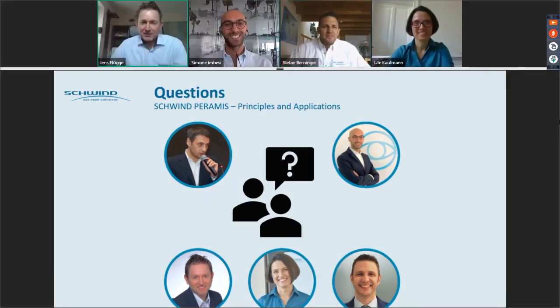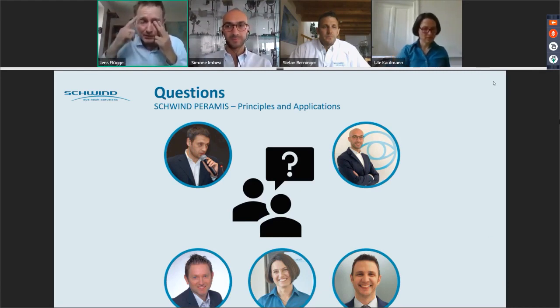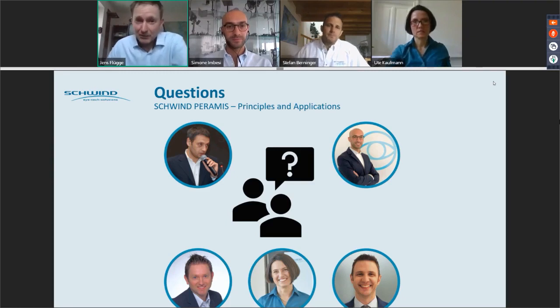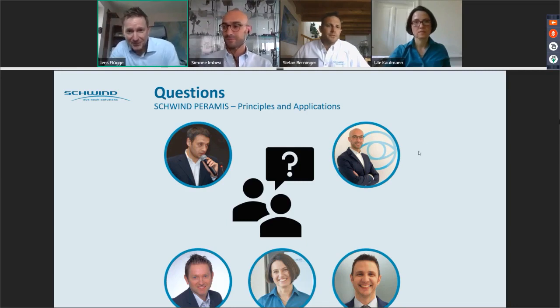Then I would just mention one more point: when you cover the eye, make sure that you're not really blocking it, because it's important that both eyes are open wide. Otherwise, if you block one, the other one cannot be open completely. So that's one comment I would like to give to this. So if there are no further questions, I would say thank you very much to everybody for participating here.